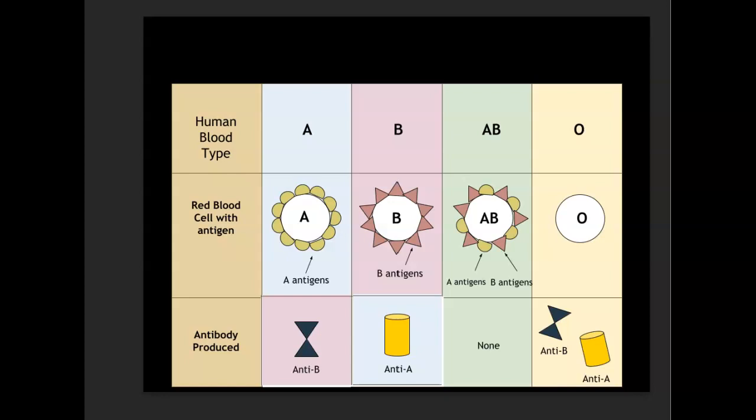In this activity, we are going to do a little murder mystery. Somebody was killed, and we're going to use blood types to figure out who the murderer was because the murderer left their blood at the crime scene. Don't you hate that when that happens?